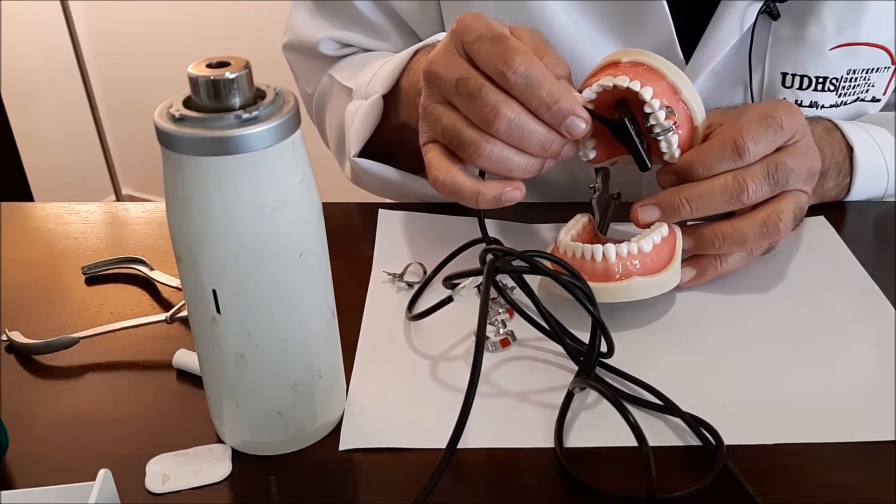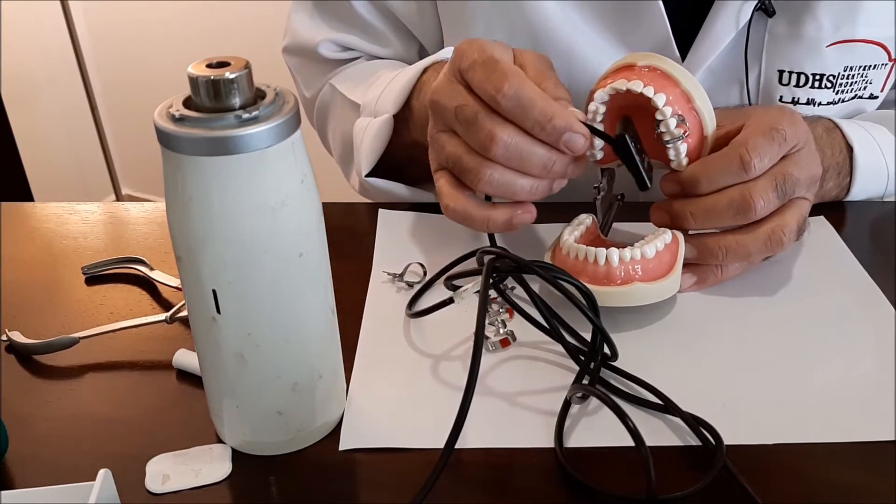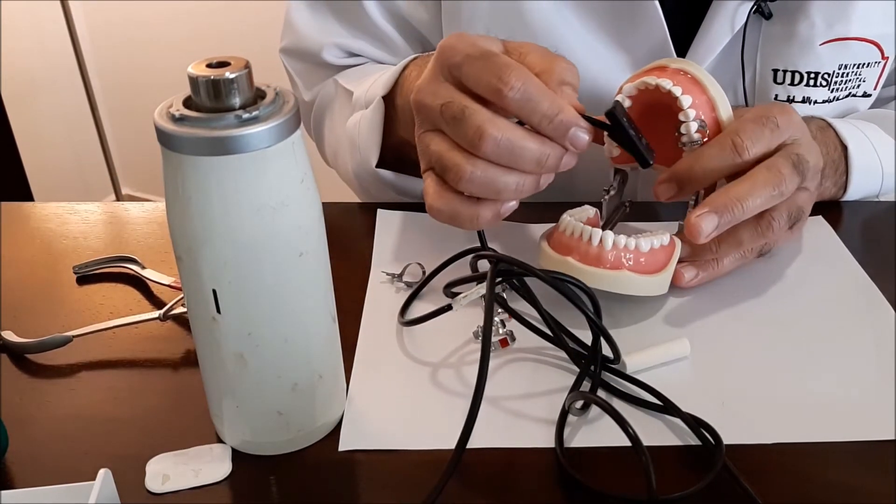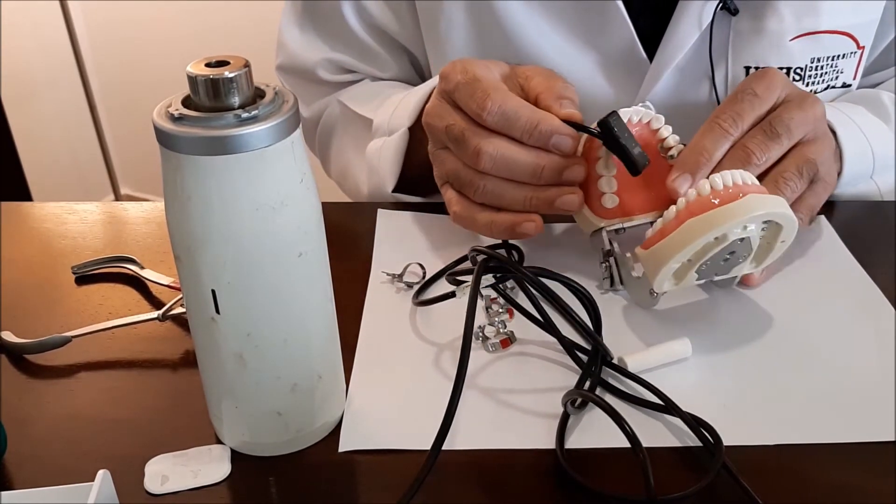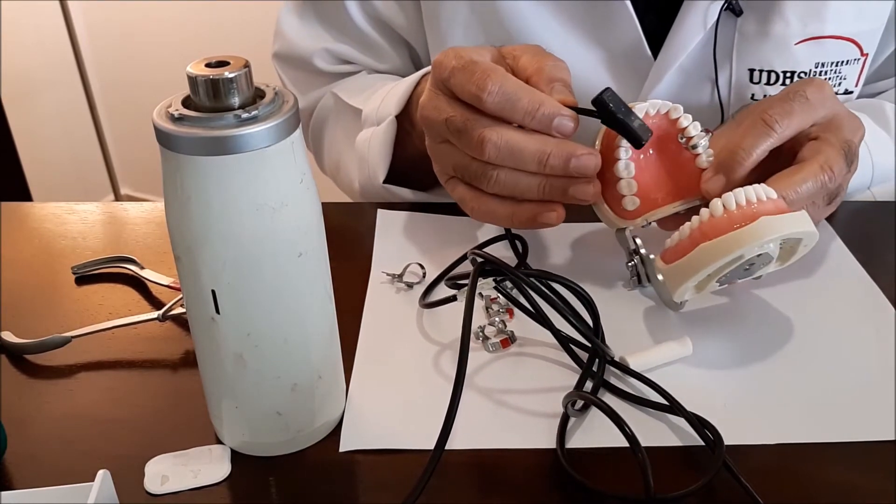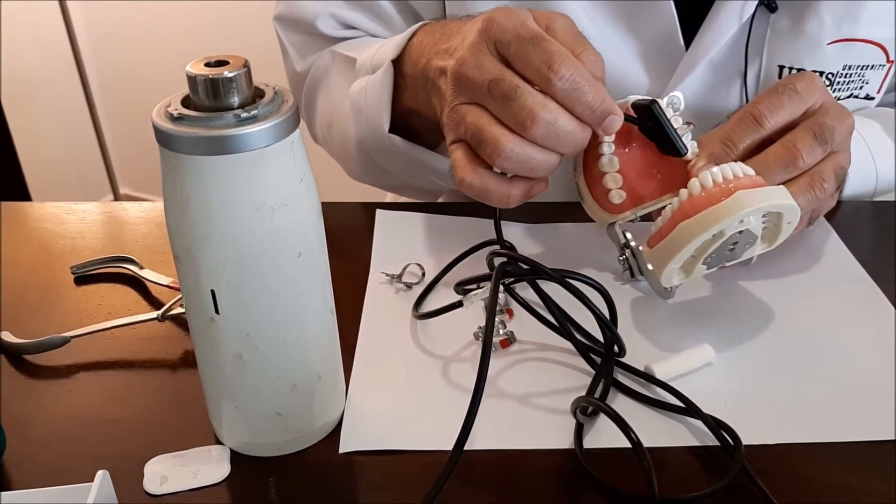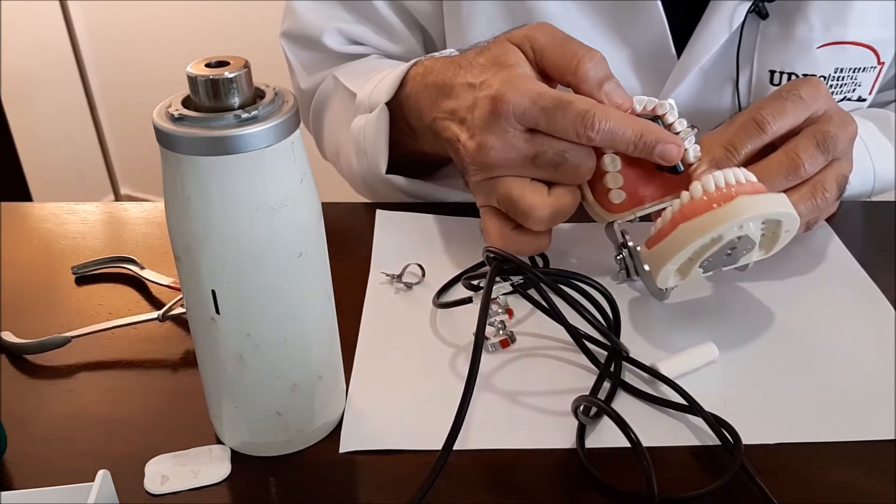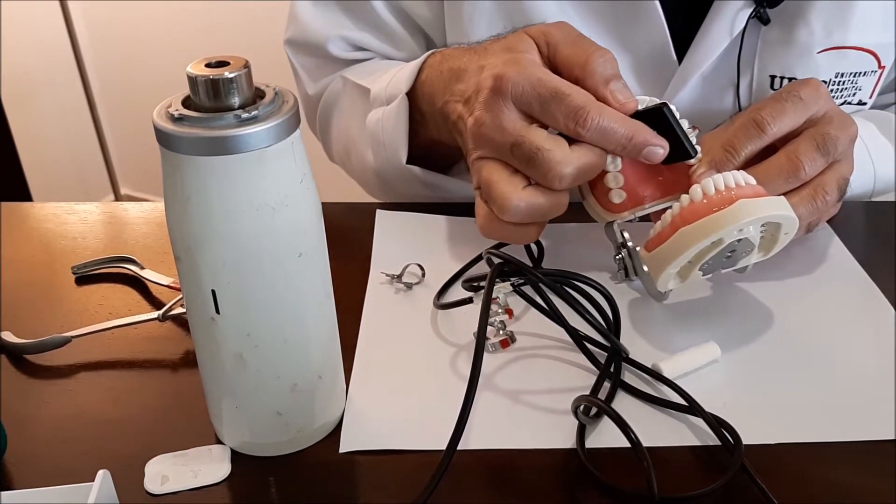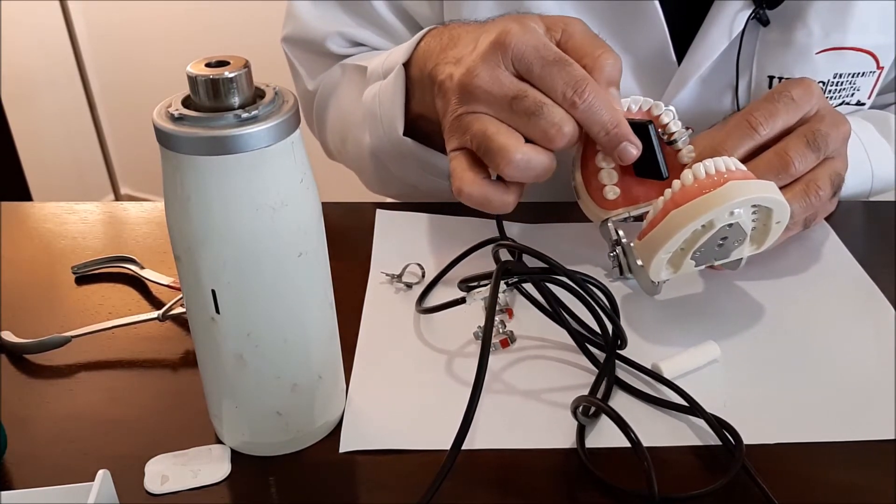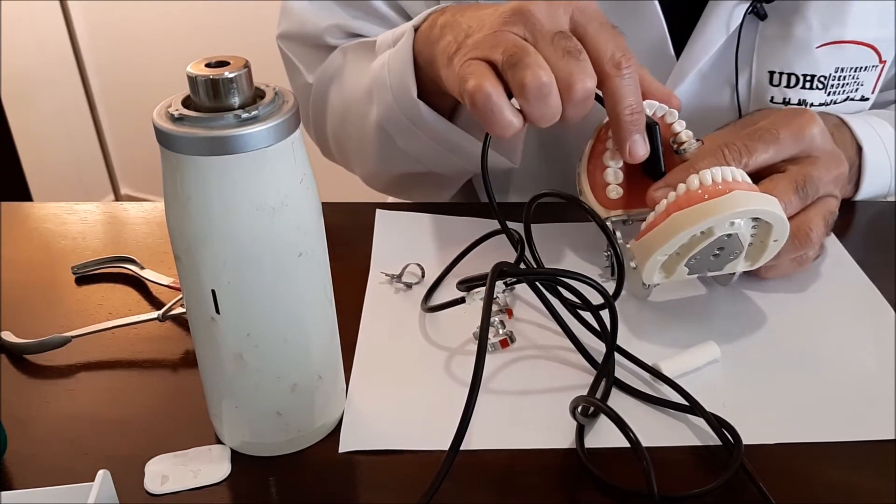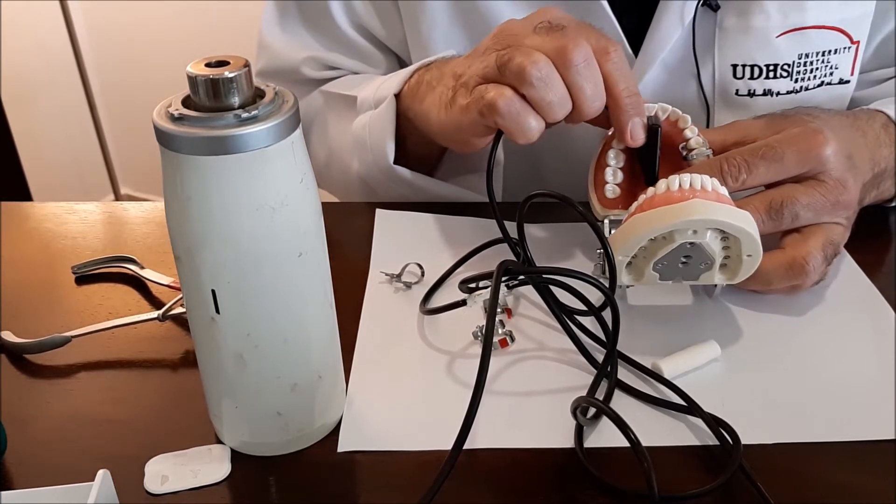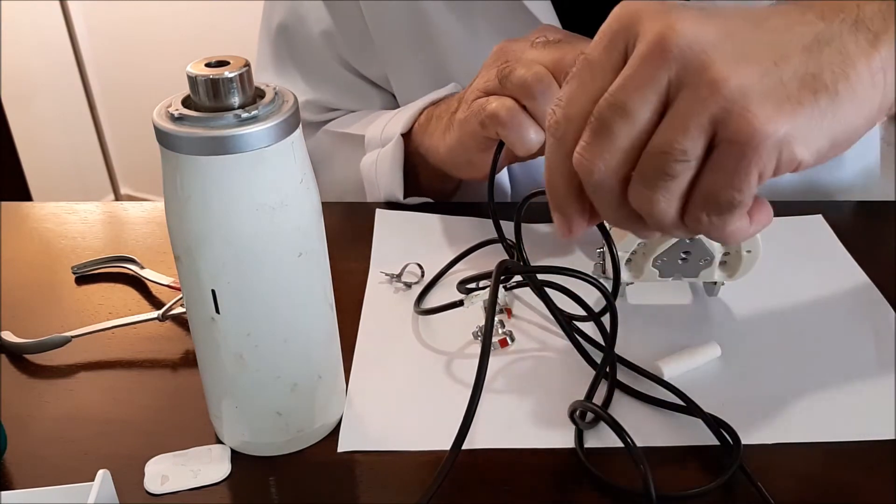The trick here is that don't stick or do not bring the sensor so close to the tooth. Try to take it out to the midline. Try to take it out towards the midline of the palate and then you are going to place the cotton roll in this direction.